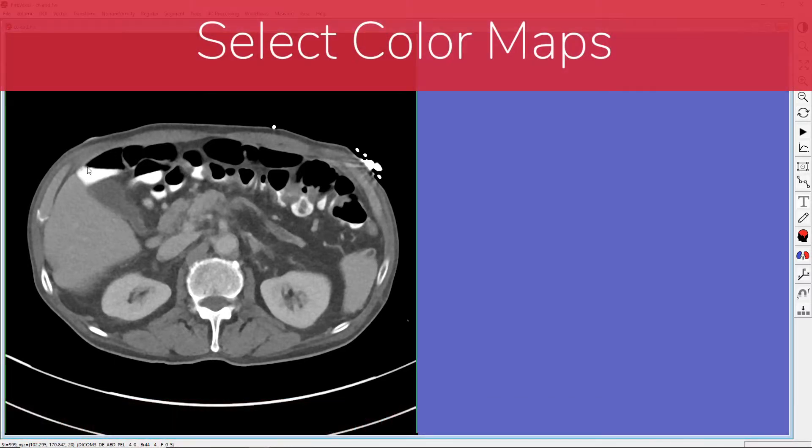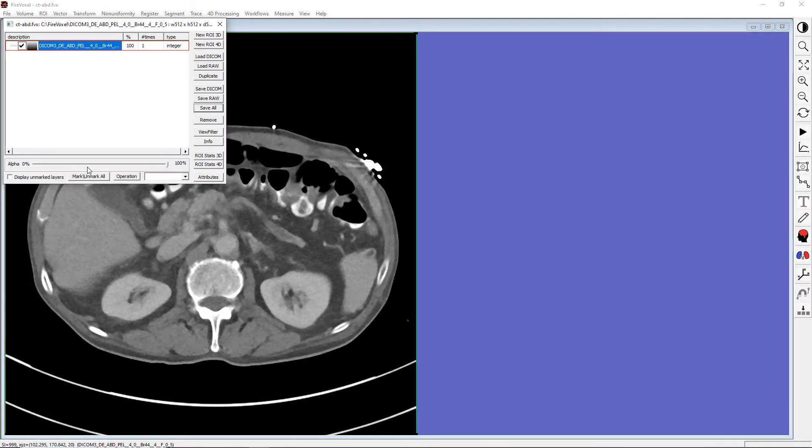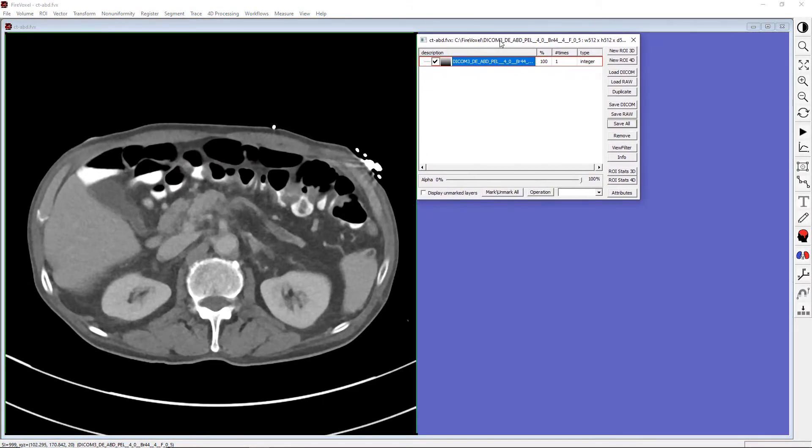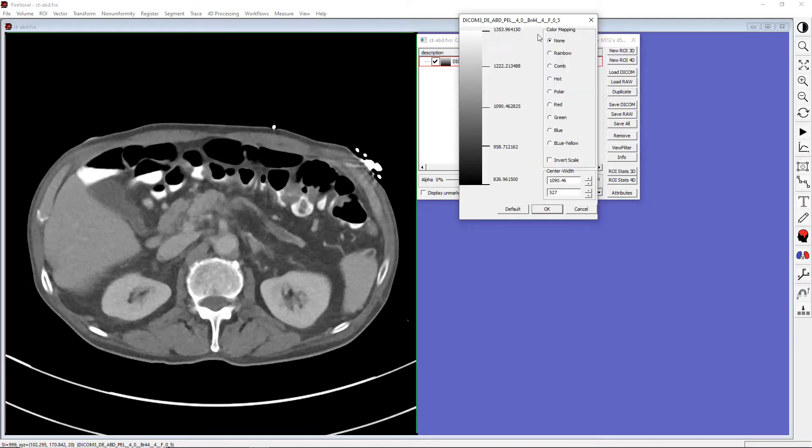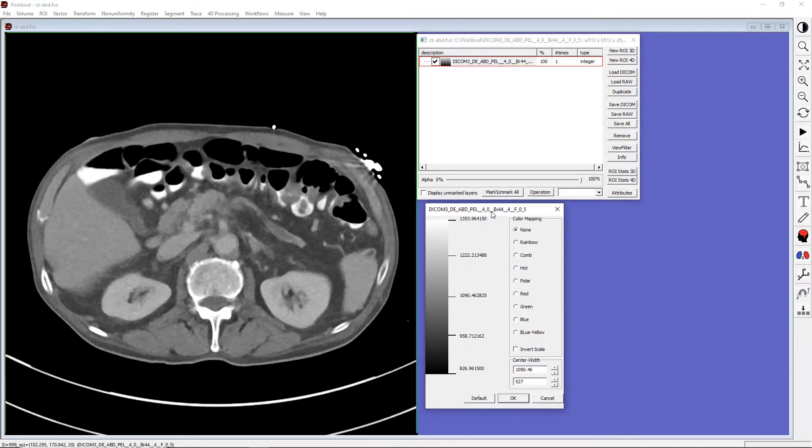You can also adjust the grayscale window or select a color map by adjusting the layer properties. Let's double-click on the image to bring up the layer control panel. Here we see our images in the active layer. And now, let's click View Filter.